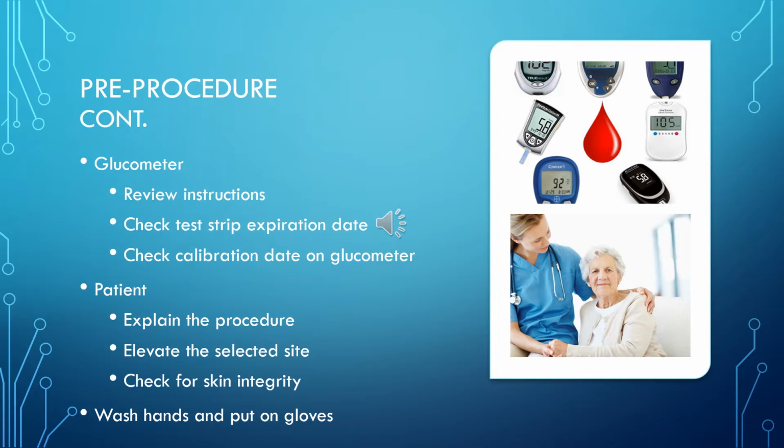The next thing we do want to do when we go in the room is talk to our patient. Explain the procedure. If they haven't had it done, that's very important to explain. If they have had it done, you still need to explain the procedure, what you're going to do. You do that anytime you have a procedure with a patient, and this is one of those times.